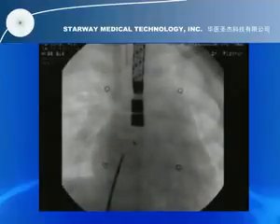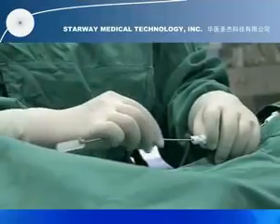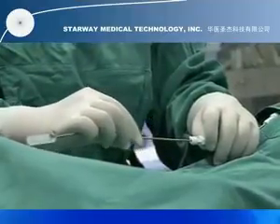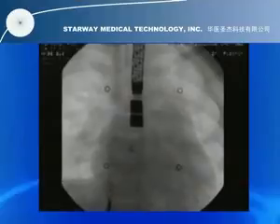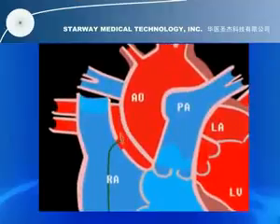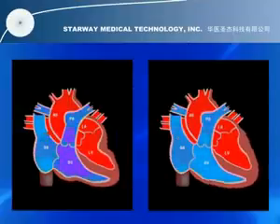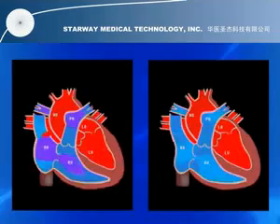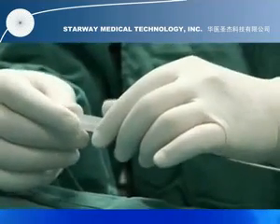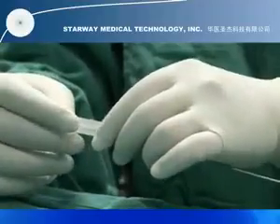With the observation of fluoroscopy and echocardiography, the delivery cable is pushed forward and pulled backward repeatedly with proper tension to confirm a stable position of the device. If misplacement occurs, the occluder can be retrieved into the delivery sheath, redeployed, or replaced by another device. The device is released by unscrewing the delivery cable counterclockwise using the plastic vise as indicated by the arrow on the delivery cable.